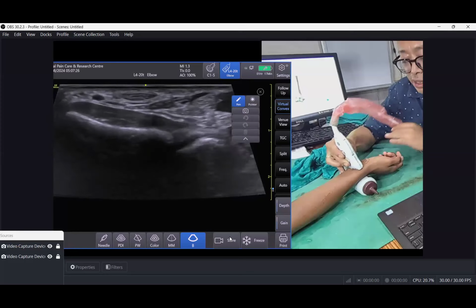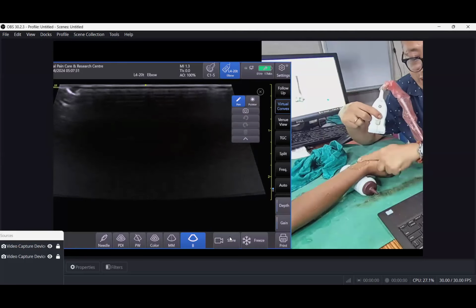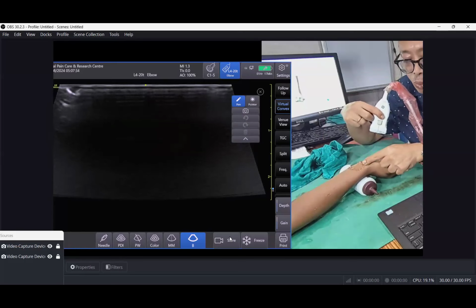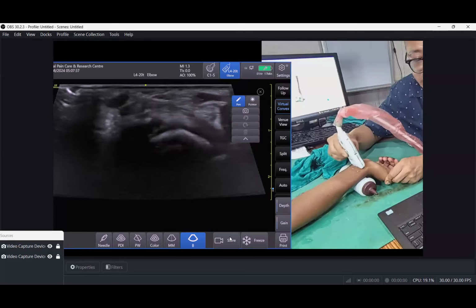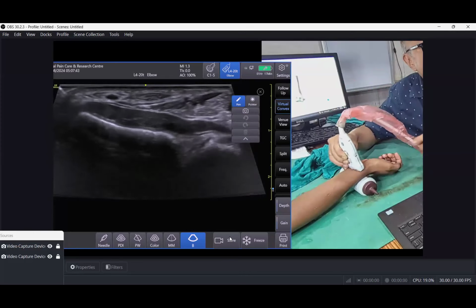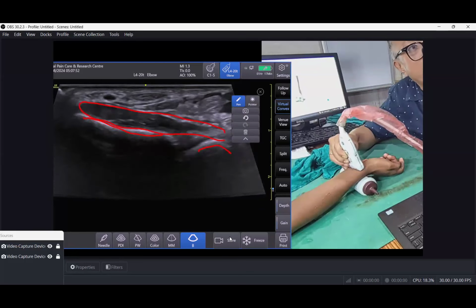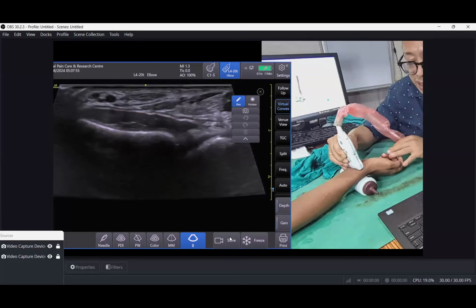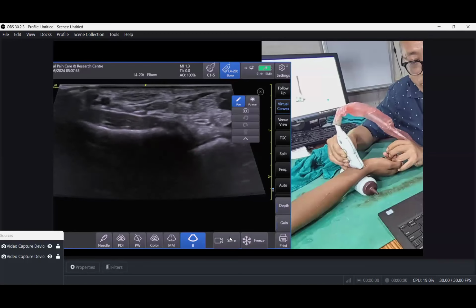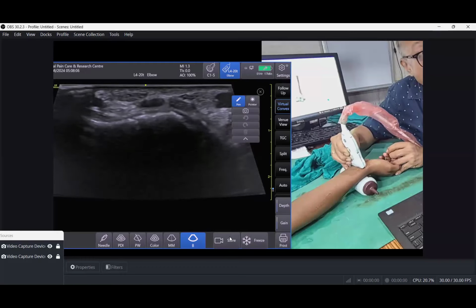But starting from here, this was our home page, the lower part of the forearm. So I'm not starting from the crease of the wrist. Okay. I'm starting about 1 inch above the wrist crease. I'm putting it like this. So this is our home page. So you should nicely see two hyperechoic structures. One radius, very nicely seen. Another is ulna. Above it, the flat muscle is pronator quadratus. Okay. So after getting this, slightly glide your probe more distally, and you can appreciate ulna is getting lost. It is vanishing because it doesn't take part in the wrist joint.